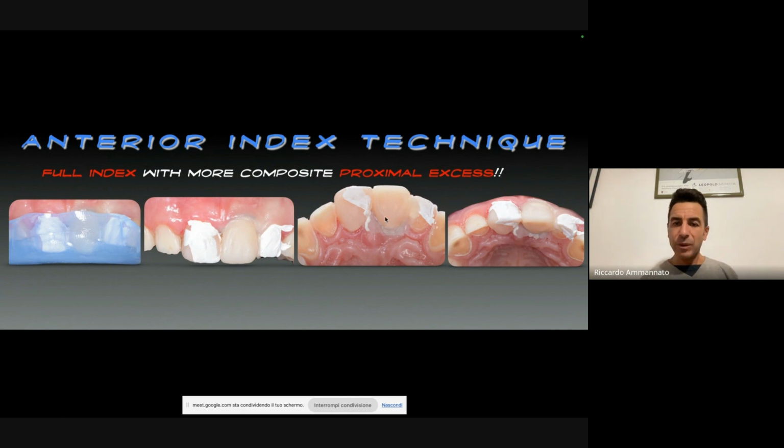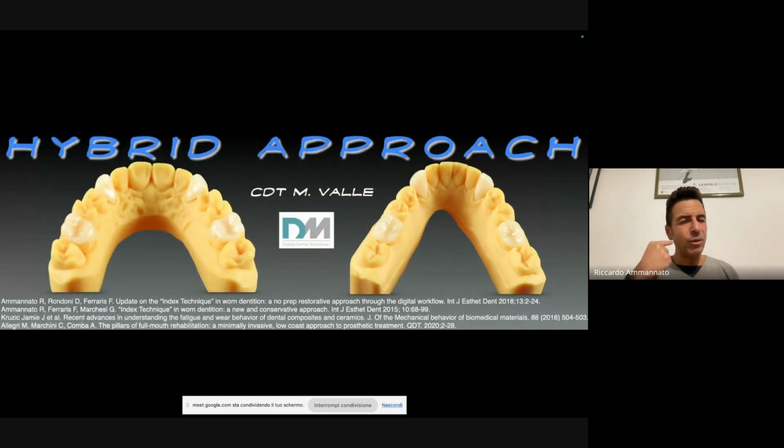So I will reach my goal at the end, but it's going to take longer. It's not going to be so easy. And then it's not going to be so predictable to have an interproximal smooth emergence profile, okay? Especially when you manage the posterior. The anterior is a bit easier, but the posterior is more difficult.